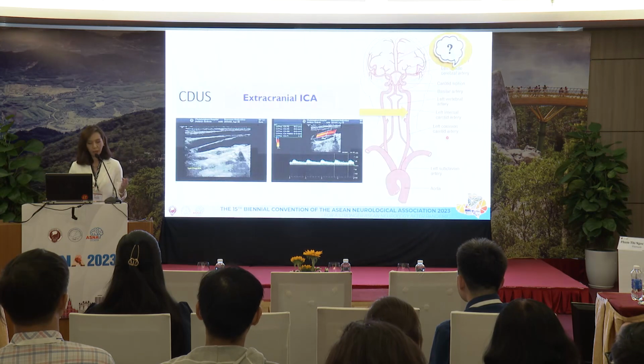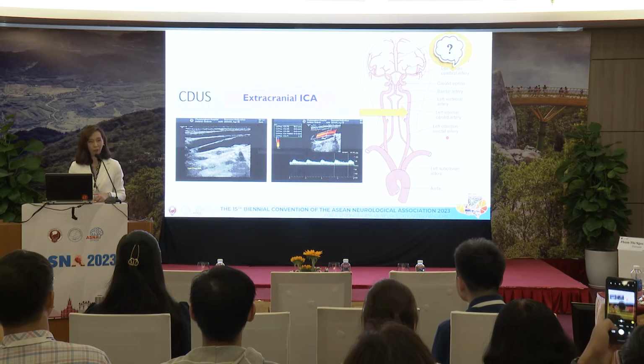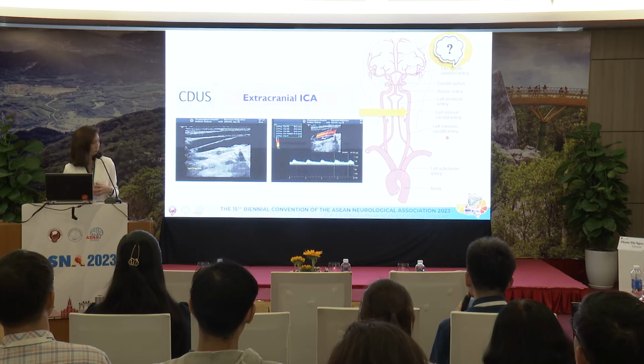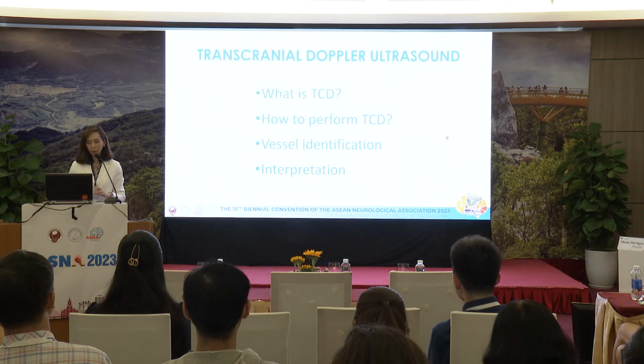We actually looked at the carotid, and Dr. Johanna Kusuma will talk about that later. But we did look at the carotid of this patient, and it shows a mild, small plaque, but no significant stenosis. So the carotid is not the cause of the TIAs. We have to look further to the vascular territory that supplies the MCA, which is the intracranial part. So that's why TCD comes along.